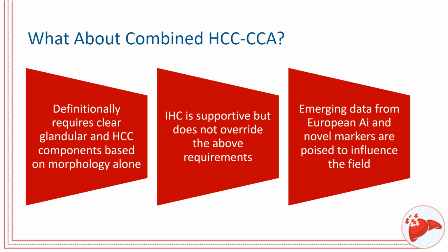I think it's important to confirm epithelial lineage. I've shown you my two key markers of epithelial differentiation, and then I confirm hepatocellular differentiation, usually with arginase and albumin ISH. It's okay to use HepPar and polyclonal CEA. Sometimes, depending on the context, you may end up using various combinations of these markers, and I think glypican-3 may be confirmatory, and I certainly would do it in addition to these in terms of completing the picture, depending on the clinical context and the available information.